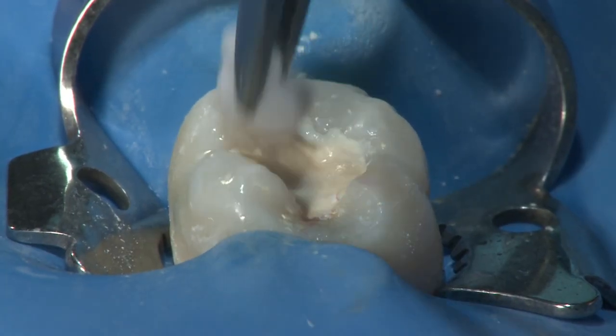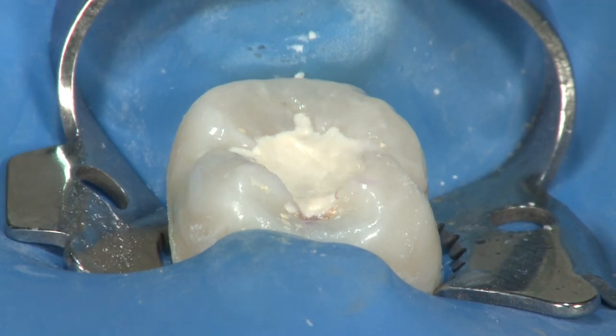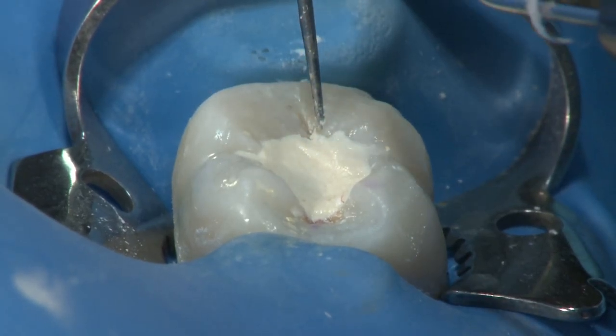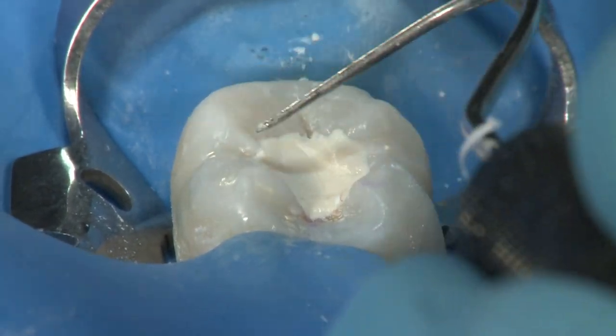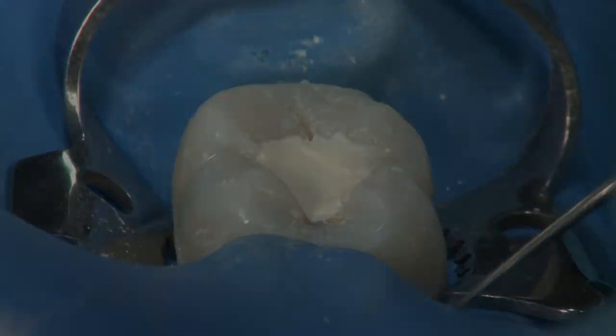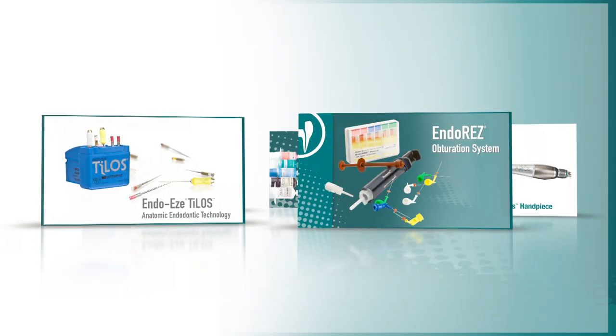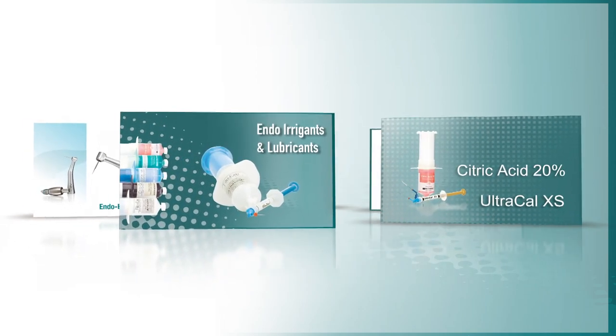Throughout this procedure, we've demonstrated how effective, minimally invasive endodontics can be performed in a safe but efficient manner. By using the natural anatomy of the tooth as a guide, dentin is preserved, thus maintaining the strength of the natural tooth. Ultradent's endodontic products solve everyday endodontic problems, giving you the ability to treat most endodontic cases with simplicity.